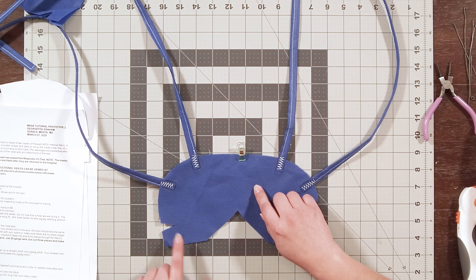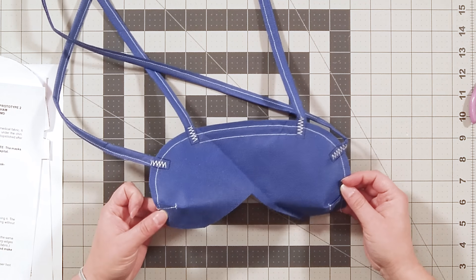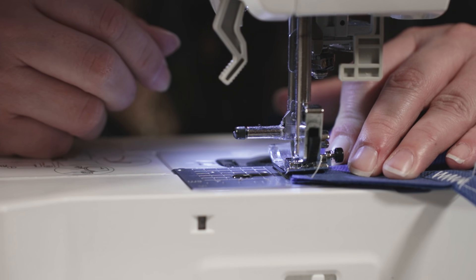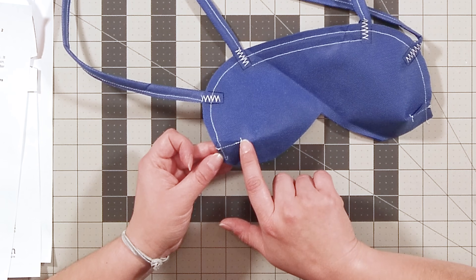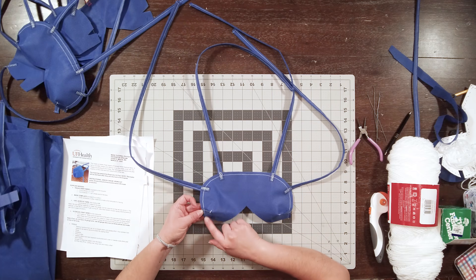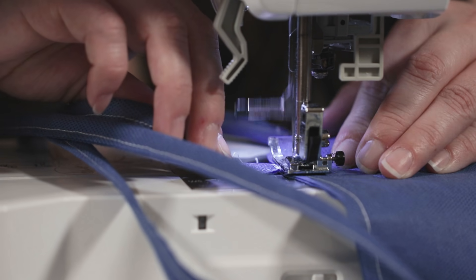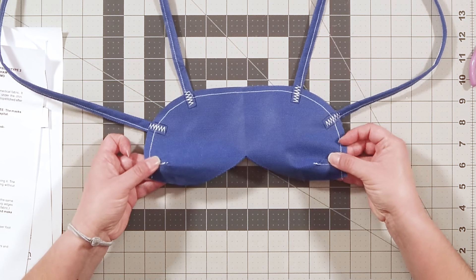The next step is to make your darts. The tutorial suggests starting at the apex and going down a quarter inch from the tip, but I found it easier to start a quarter inch away and go towards the apex — I thought that was simpler. Once both darts are completed, you top-stitch all the way around the mask, making sure the darts are pointing towards the curved end. Here you can see both darts are facing up.